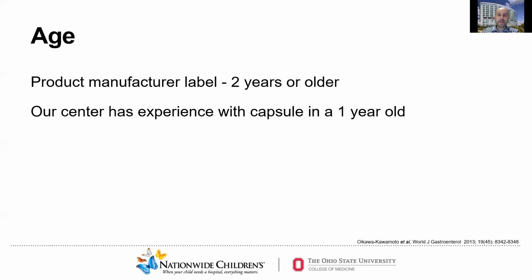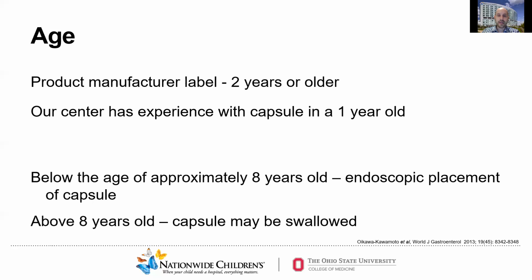A word about age and video capsule endoscopy. Most capsule manufacturers label their capsules down to 2 years of age. However, our center and others have experience with capsules in children as young as 1 year old, and there is a small literature on that topic as well. Below the age of approximately 8 years old, endoscopic placement of the capsule is indicated because the child cannot swallow a capsule of that size. Above the age of 8, the capsule can be swallowed.